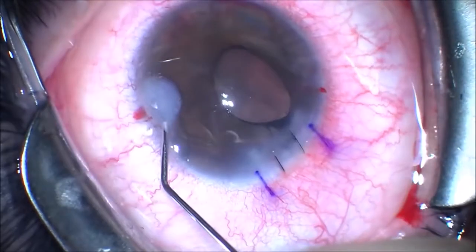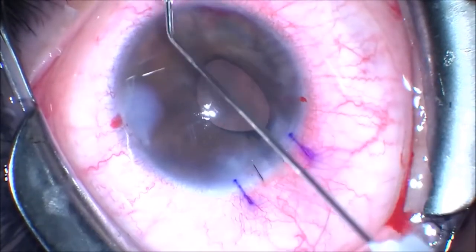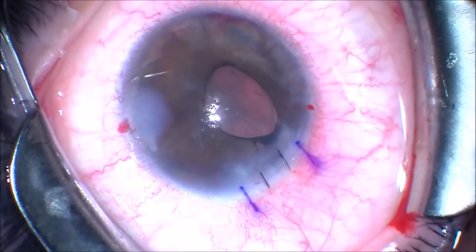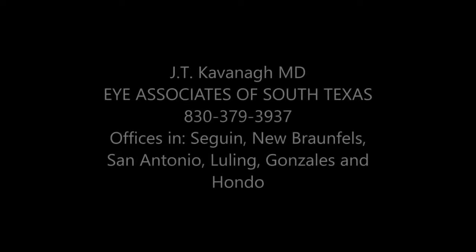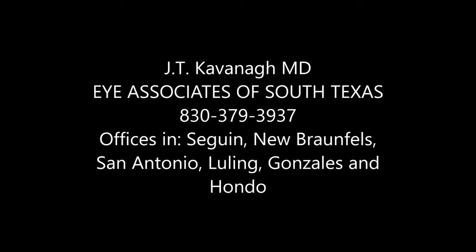The reasons for removing the iris implant in this patient were chronic iritis, glaucoma, and the starting of cataract. The patient tolerated this procedure well and was seen 20/30 the next day in clinic, and intraocular pressure was within normal limits. Thank you for your attention.